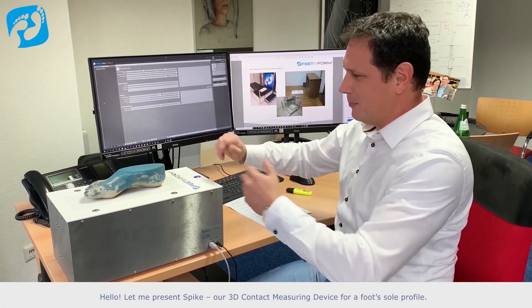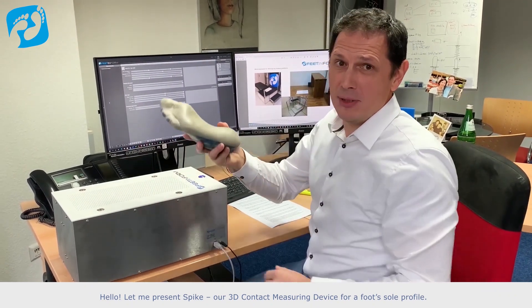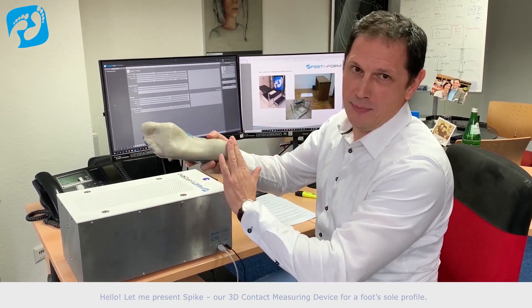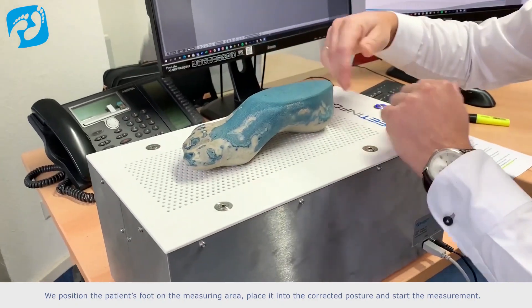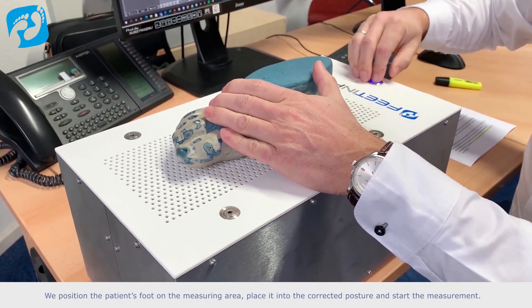Let me present Spike, our 3D contact measuring device for a foot's sole profile. We position the patient's foot on the measuring area, place it into the corrected posture, and start the measurement.